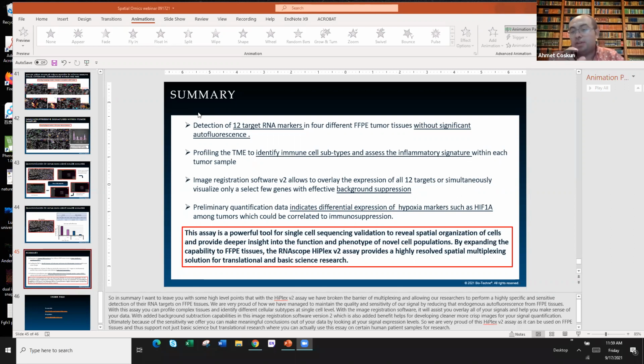So these kinds of things would be interesting to see for RNAscope too: what are the detection advantages or disadvantages? Because it will affect our scientific questions as well, right? When we look at, for instance, the CD8, CD3 copies, I'm not sure how many copies that is per cell in immune cells, but to identify an immune cell as CD3, what's our threshold? If there's a non-specific binding of like 3 or something, will we accept it as an immune cell, or is it some other cell that we will not accept?